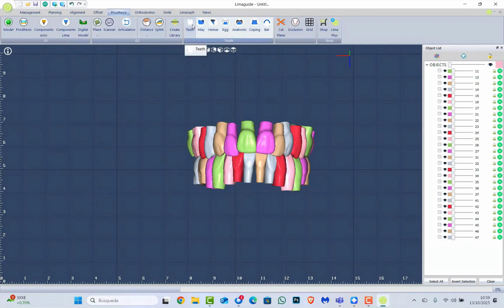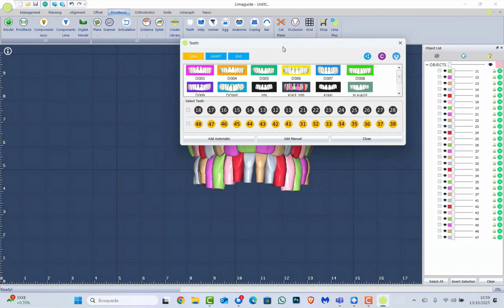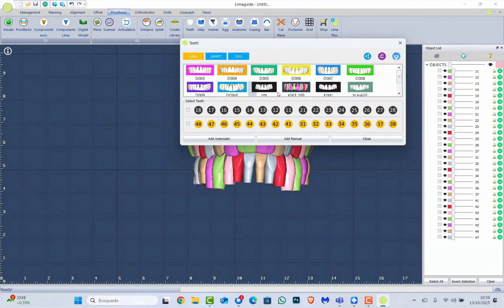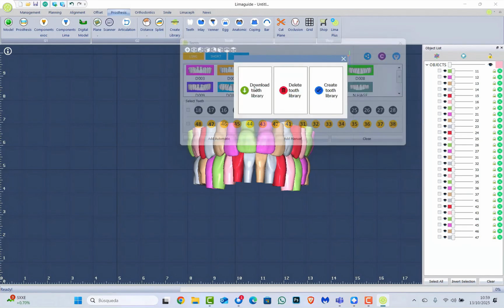I click here on teeth. And as you can see here, I have all my previously uploaded libraries. As you can see, we have these three icons here. I'm going to click on this one. And as you can see, we have three options here. I can download, delete, or create new teeth libraries.